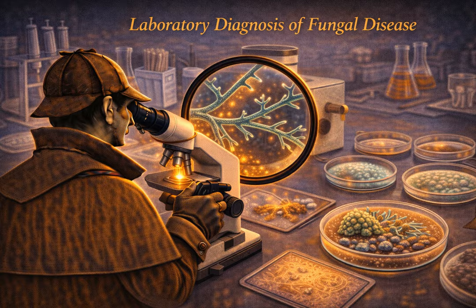Prompt 2. You have a tissue biopsy from a diabetic patient with severe sinusitis and a black eschar on the hard palate. You strongly suspect mucormycosis. You explicitly instruct the lab not to grind the tissue. Why? Pause. The answer is grinding destroys the fragile non-septate hyphae. Mucormycetes have broad, pauci-septate hyphae. They act like fragile glass straws. Grinding mechanically kills them, leading to a false negative culture. You must mince the tissue instead. Reference Murray Chapter 60, specimen collection.